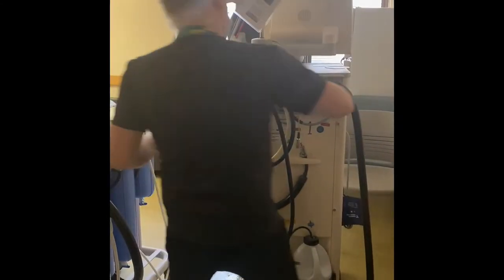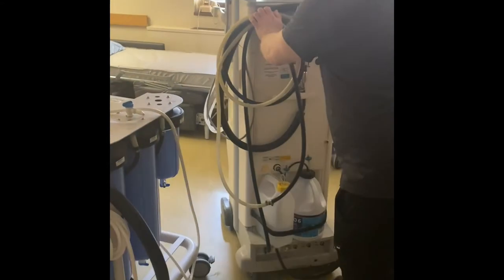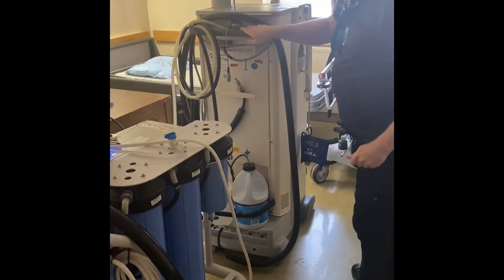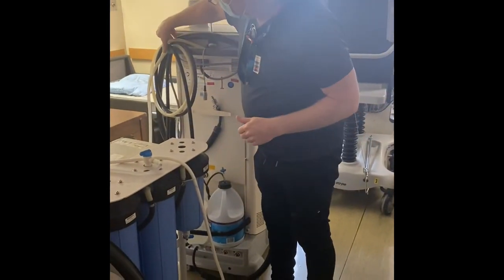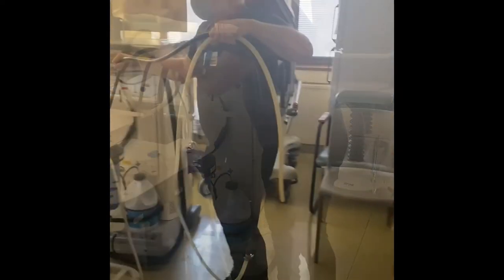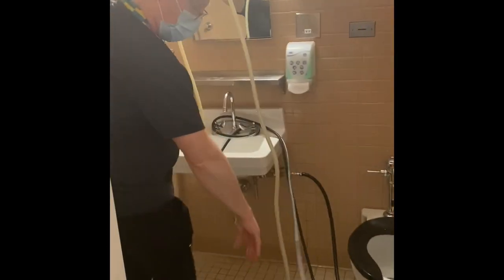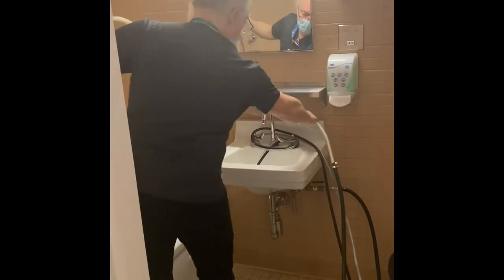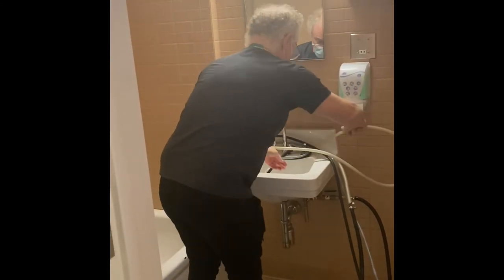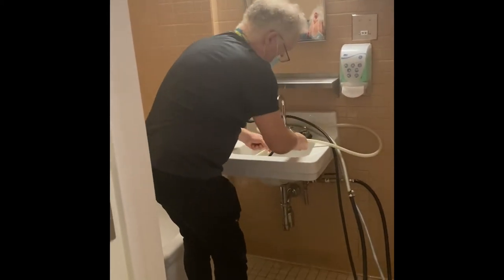Now for the dialysis machine. Move it closer to the patient. Connect the drainage first — same as the Aqua Uno. Bring the hose to the wash basin and wrap it around the faucet to secure it.